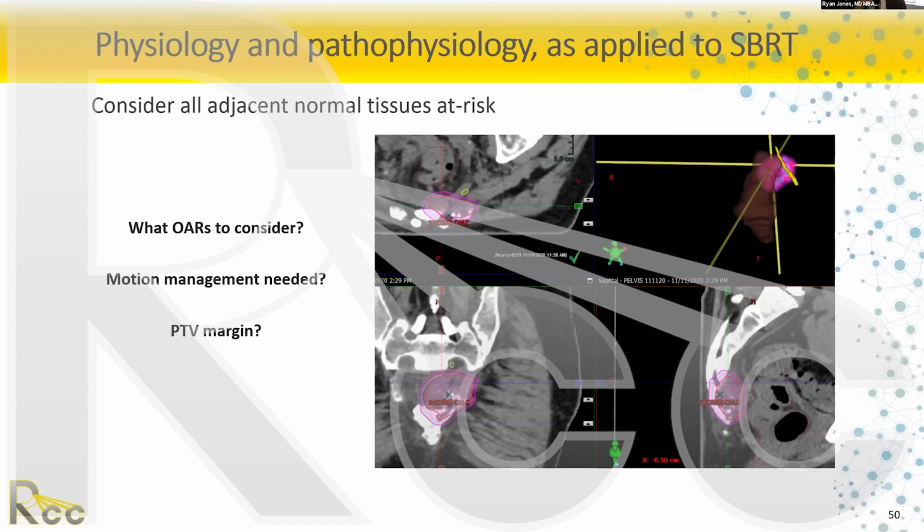So one of the schools of thought I was trained under, Timmerman had observed some marginal failures in bone for bone mets, where he had later on adopted a 5 millimeter CTV margin in bone, which is seen here in blue. Depending on as well, often you'll get an MRI for treatment planning if you have it available, and it will show you disease beyond what is on CT.